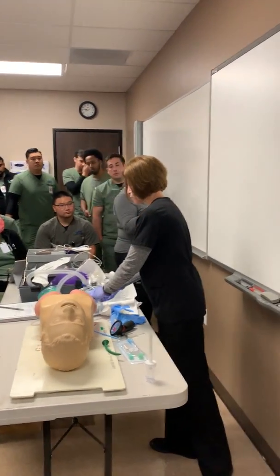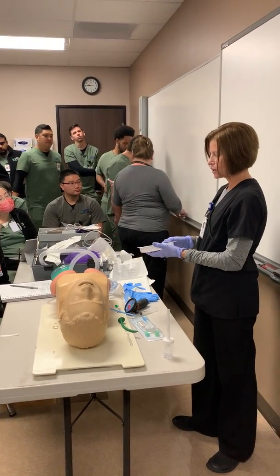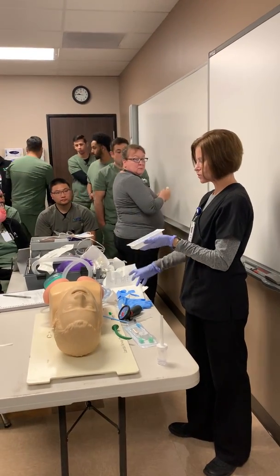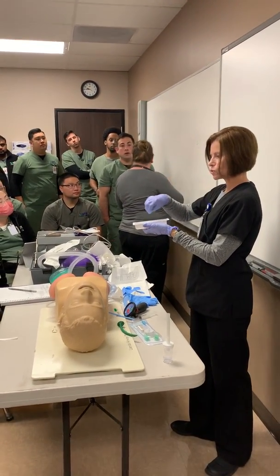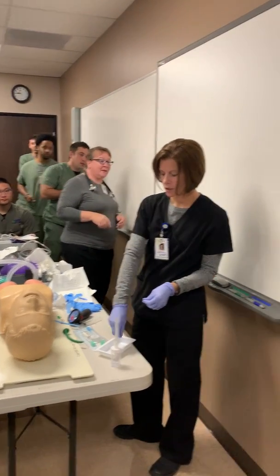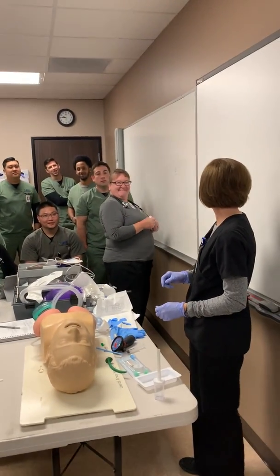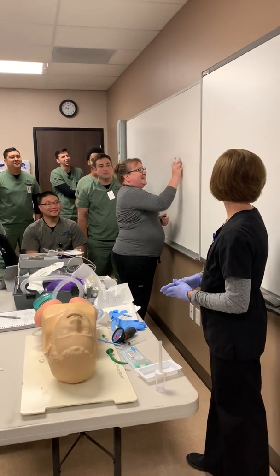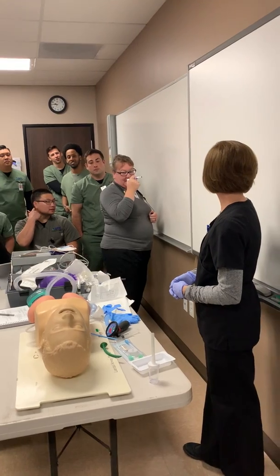Oh, so sometimes you're going to have to rinse the catheter between passes. If you have a little basin like this, or some have a little cardboard box, you would open it, squirt some of the saline bullets in there, and when you have your catheter, suction it through there, and that cleans it. Sorry, Ms. Sharon. Yeah, some of them have the basin, some of them don't.